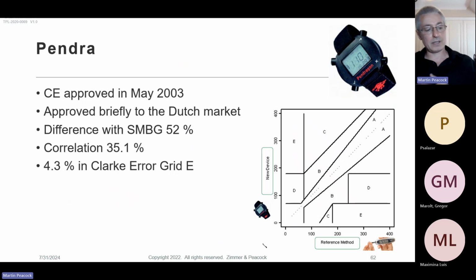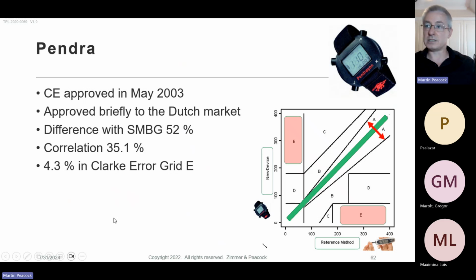It's interesting, because sometimes people think that they need to be 99% accurate, 95% accurate. For an in vitro diagnostic or a point of care diagnostic to be useful, it actually only has to be 70% accurate. Don't jump on me on that, but that's actually the guidelines. Now people aim for higher. When you look at glucose meters, they are accurate to about plus or minus 15%. So just be careful about the accuracy you require. But there is a moment where you can be so grossly wrong that you can cause harm to the patient. So accuracy is important, but it's not the 99% accuracy that people sometimes think they need.